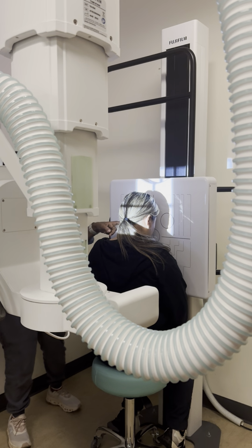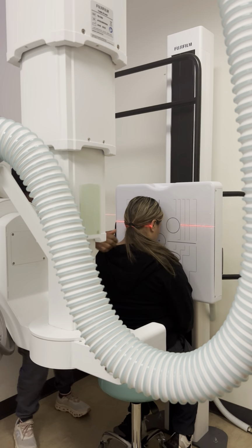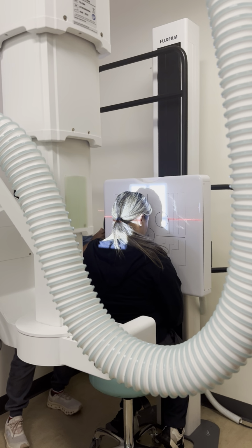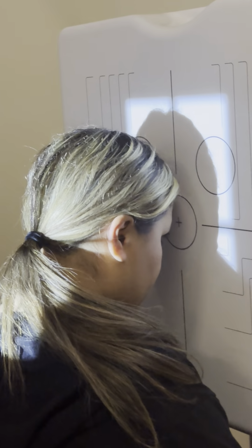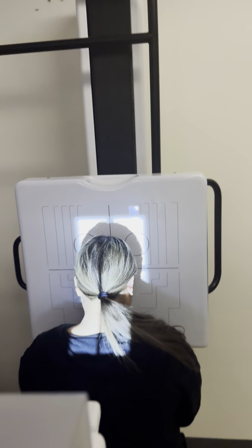Yeah, the outer canthus and the ear hole. And now we're exiting the Nasion. This is just the PA. Oh, and that line. Okay? Perfect. Yeah, the lateral.